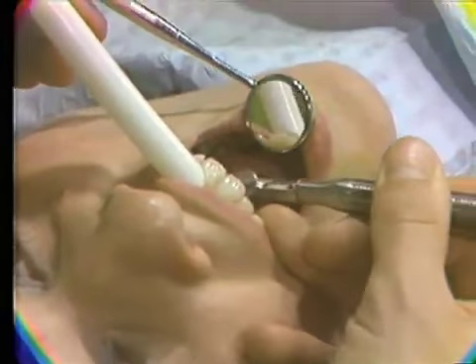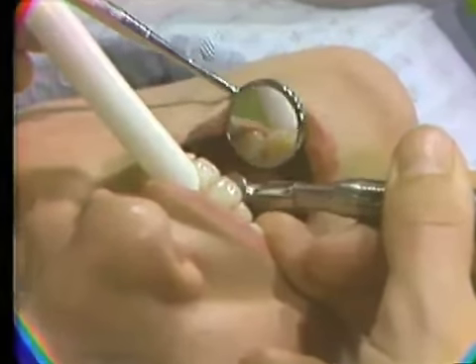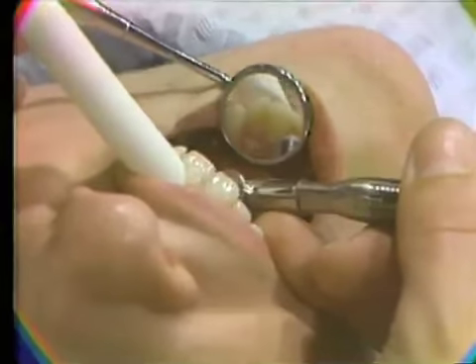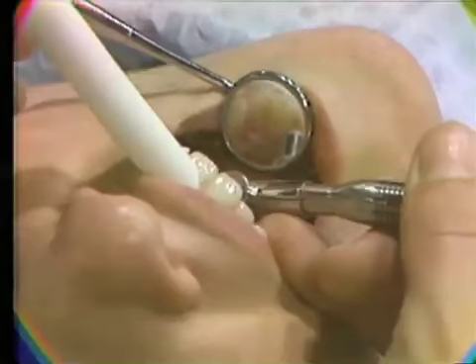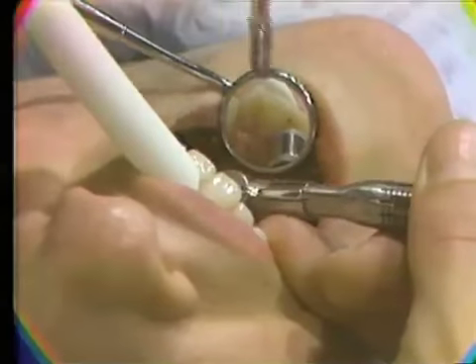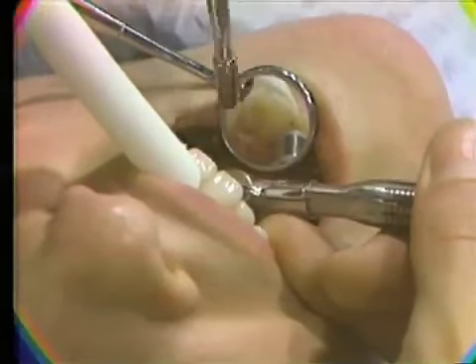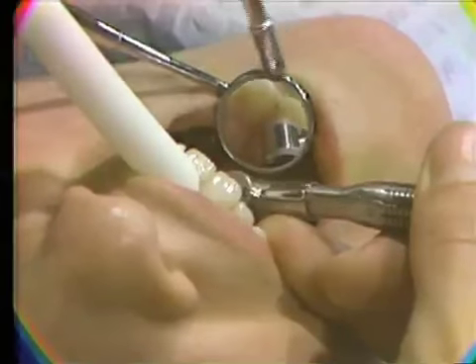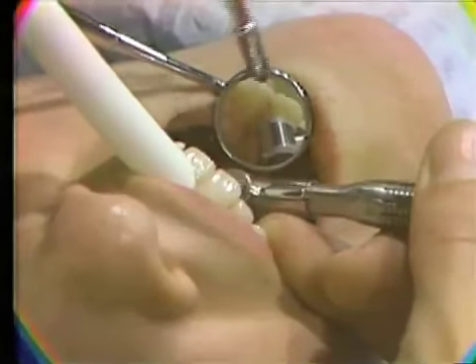The oral evacuator is used in cases where it is necessary for the assistant to use her left hand to operate the air-water syringe to keep the mirror surface clear of debris. Finger rests are established on either the incisal edges of the adjacent anterior teeth or on the occlusal surfaces of the maxillary right bicuspid teeth.